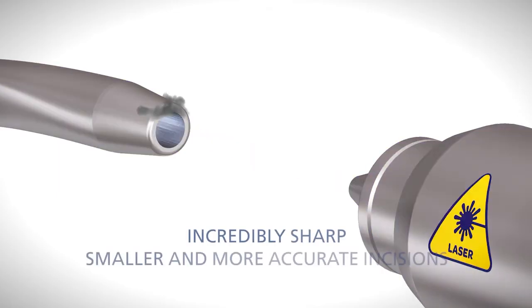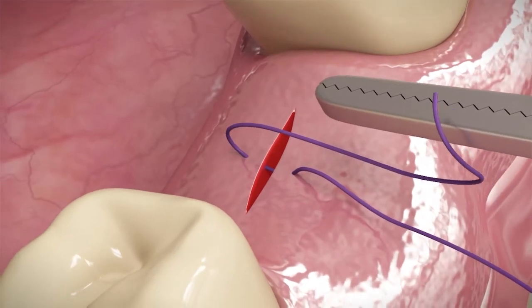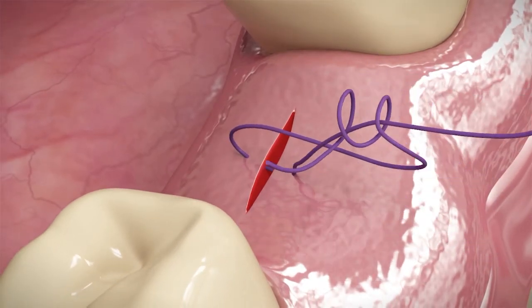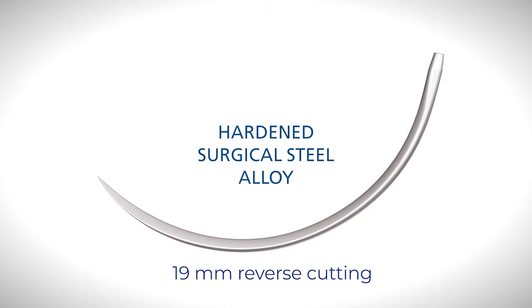The needle is incredibly sharp and fine, allowing for smaller and more accurate incisions. This translates to less trauma to the surrounding tissue and a quicker healing process. The needle design allows for smoother and easier penetration, while a 3/8th needle curve allows you to pass from the buccal to the lingual surface in one motion. Made of hardened surgical steel alloy, it won't break or bend and will stay sharp during use.